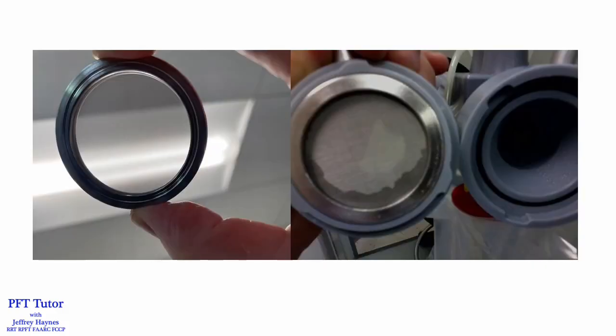With these pneumotachs, the screen itself can be a problem. If the resistance across the screen increases, the pressure differential will increase also, and the recorded values will be falsely high. We blow compressed air through the screens every morning to prevent the buildup of shards of filter material. In this case, I opened up the pneumotach, took the screen out, held it up to light to make sure it was clean.